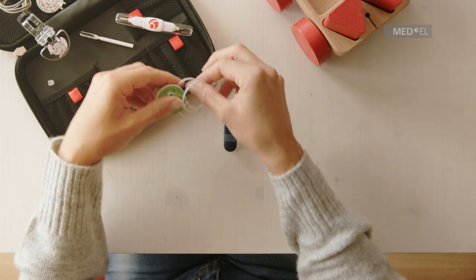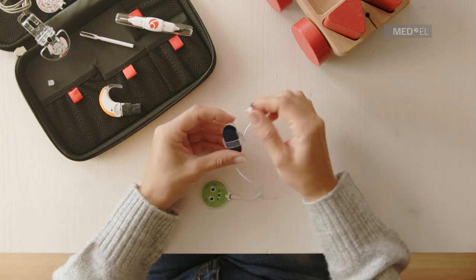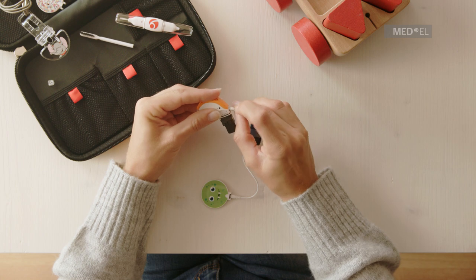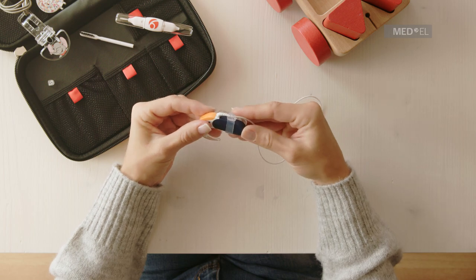Slide the end of the 28 centimeter coil cable through the ring in the attachment clip. Plug the coil cable into Sonnet 2. Then slide the battery pack cover over the battery pack and turn the lock to the horizontal locked position.